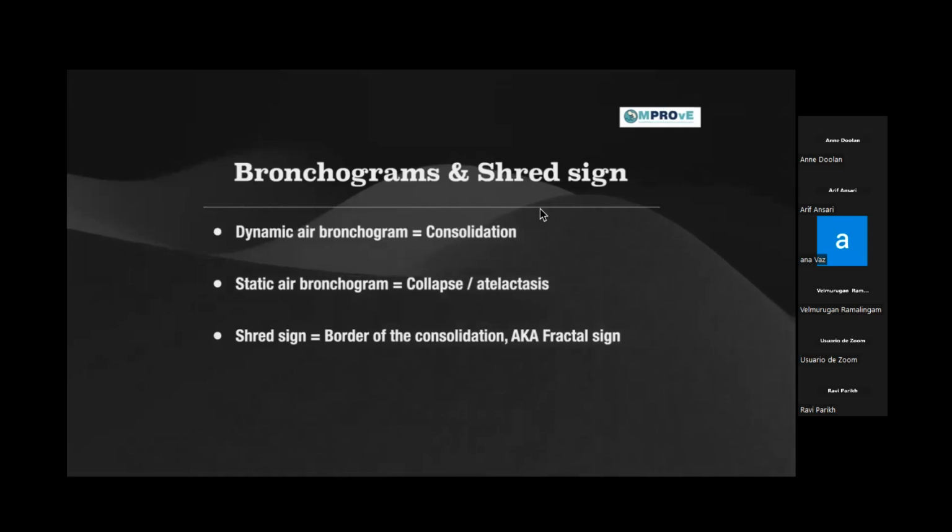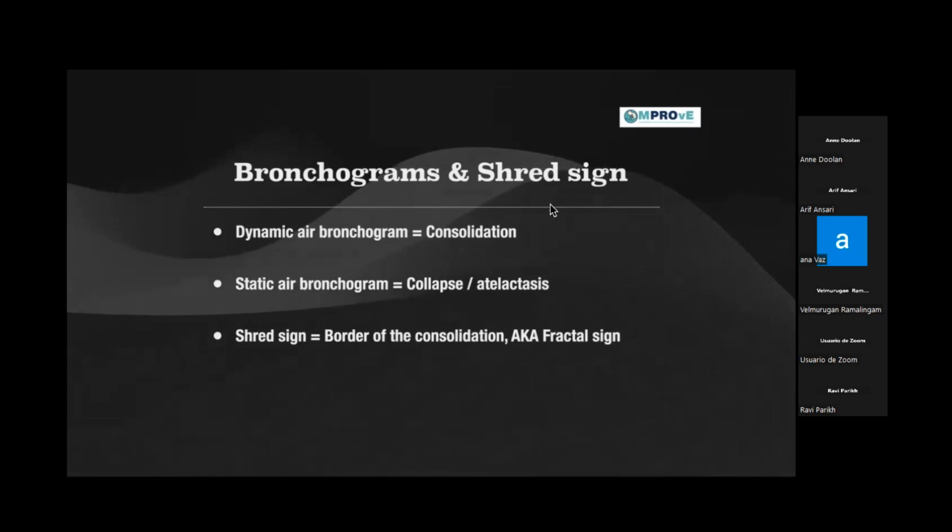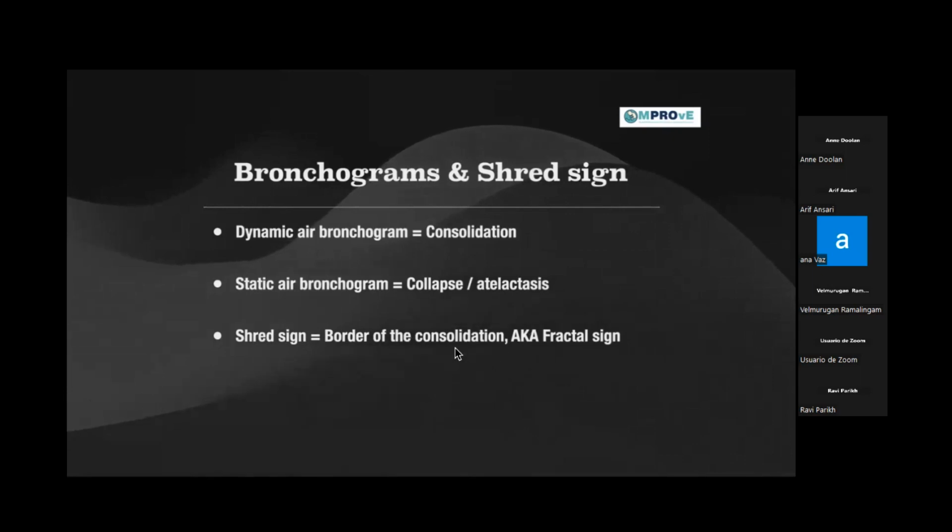Again, let's not dwell too much on bronchograms and the shred sign, because it will be too much for one single session. And we're going to deal with this when we talk about the particular pathologies. I'm going to revisit this again there. But just know that you do see bronchograms and the shred sign when you're dealing with collapse, atelectasis, and consolidations.